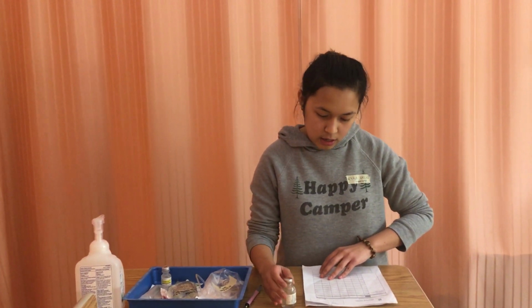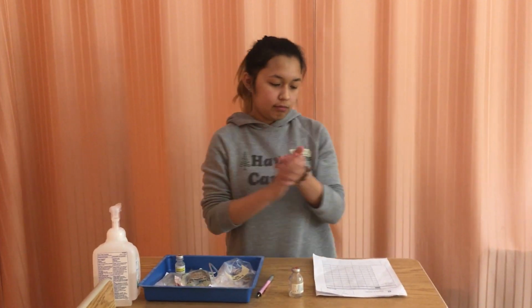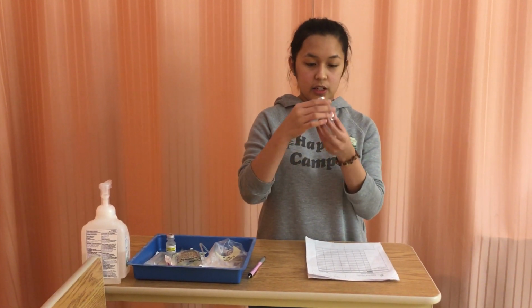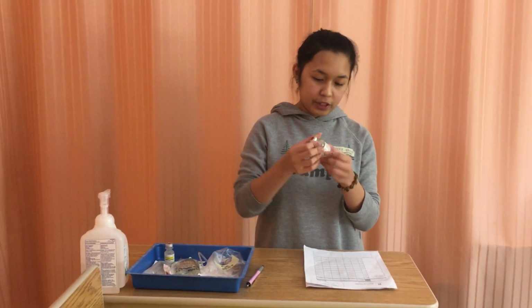So I'm gonna do hand hygiene. Now before I reconstitute, I'm going to check for the integrity of my medication, make sure that it is not expired and that it is not broken.